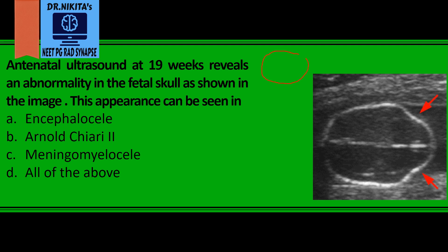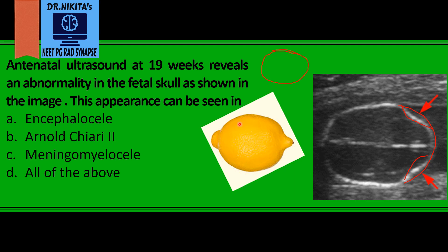A normal fetal skull should have a round or oval shape, just convex throughout. But what we see here is that instead of being a normal round shape, the frontal bones have become concave. This appearance is like that of a lemon — that is the fetal skull with frontal concavity — so it is called the lemon sign.